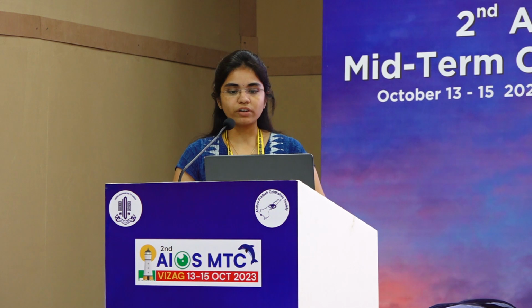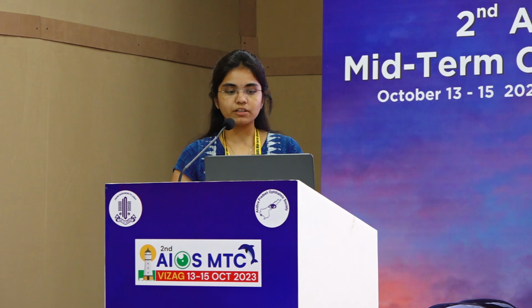Introduction: ultrasonography is one of the most useful non-invasive techniques for evaluation of the posterior segment of the eye. Baum and Greenwood developed the first brightness mode scan in ophthalmology. The first commercially available B-scan was introduced by Coleman and associates in the early 1970s. Thereafter, Bronson introduced a portable contact B-scan machine for ophthalmic use.